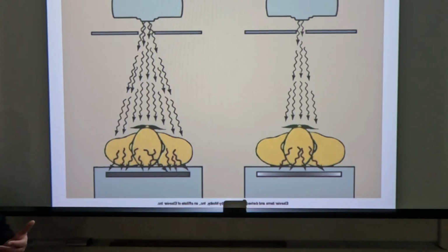So it goes into the formulation of your index number, and your index number, even though you might have used the right technique, because it gets all that direct exposure to that portion of the image receptor, it's going to think you overexposed the patient. Your index number is going to come out, depending on the manufacturer, either too high or too low, right?